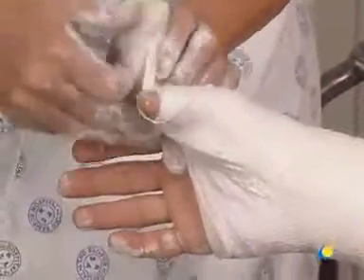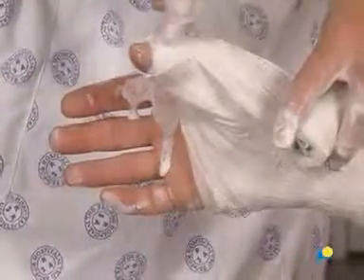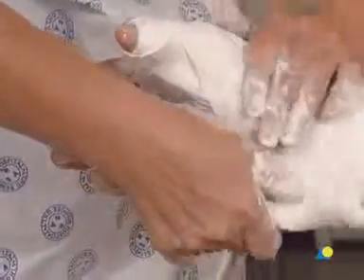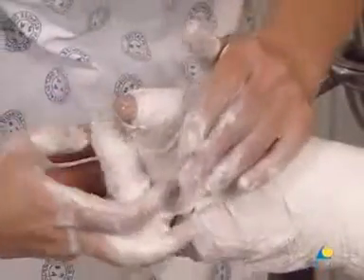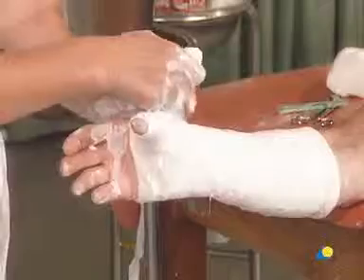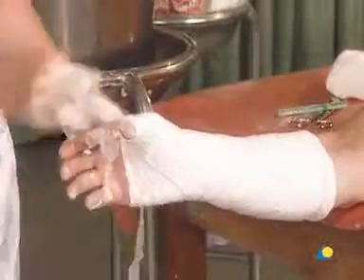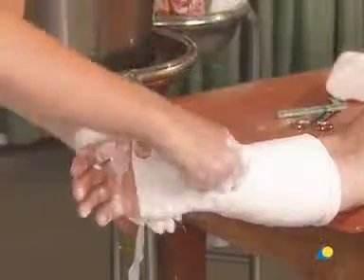The full width of the bandage, rolled on around the thumb, forms a V at the base of the thumb. This step is repeated. Although there is no bundle of plaster at the base of the thumb, it has been sufficiently immobilized. The plaster bandage is then passed through the first web space, around the wrist, and towards the elbow.